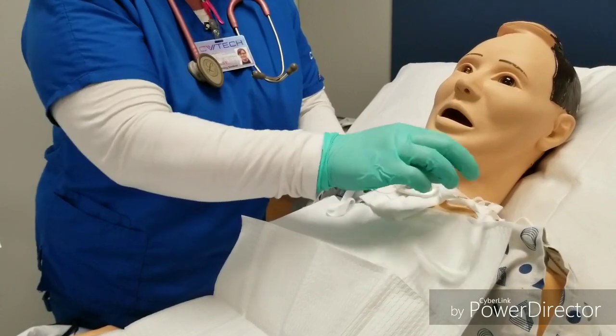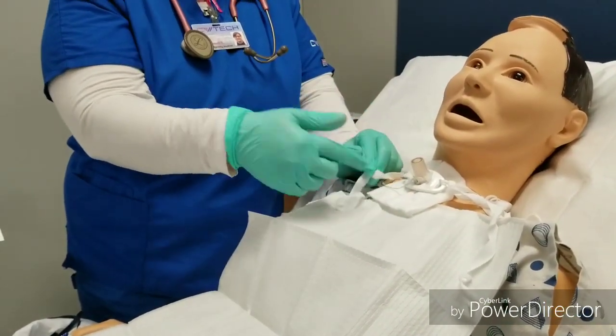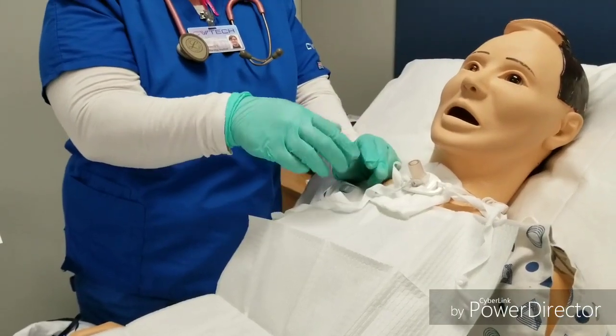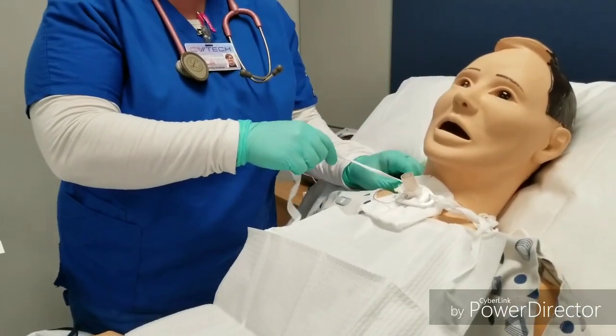Once these are secure, you can remove the old one, because if you remove the old tie while you're preparing this one and you're by yourself, the patient can cough and that thing goes flying out, and then we have a problem.